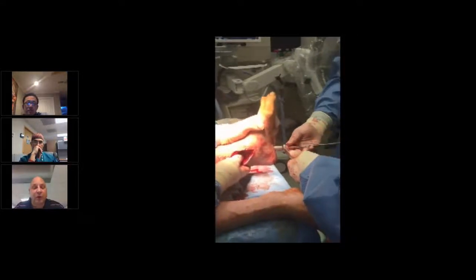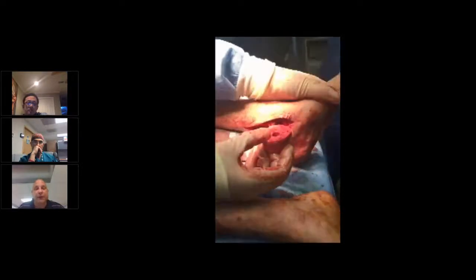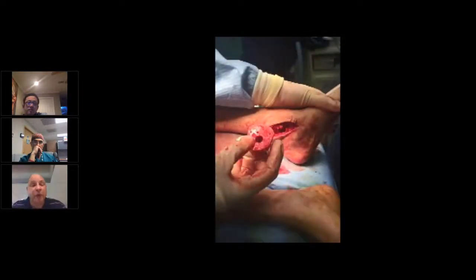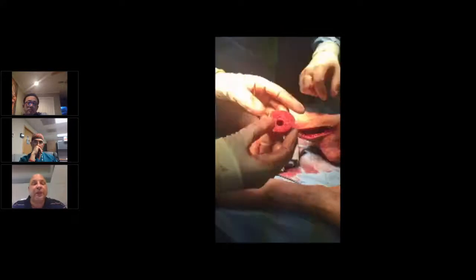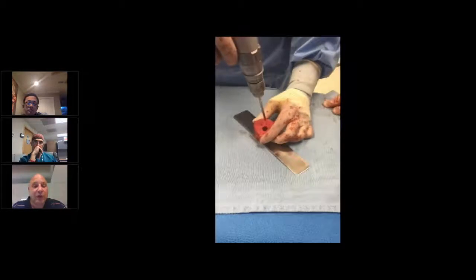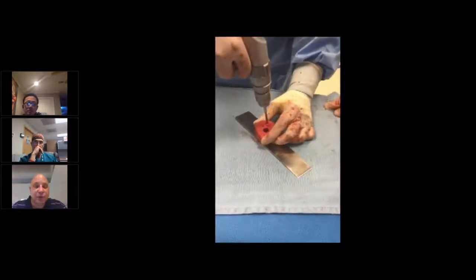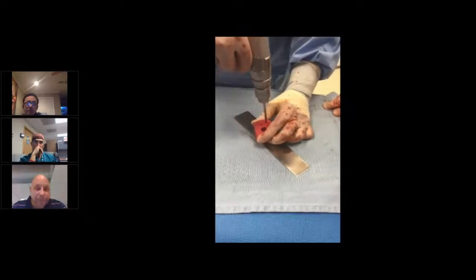Once we get the hole of the correct size, then we pull the implant out, and then we're going to prepare it. And we prepare it using everything that we can possibly do to make this become a success. What we do is we drill sequential holes all around the periphery of the bone graft, being careful not to violate the larger hole or the cortex.